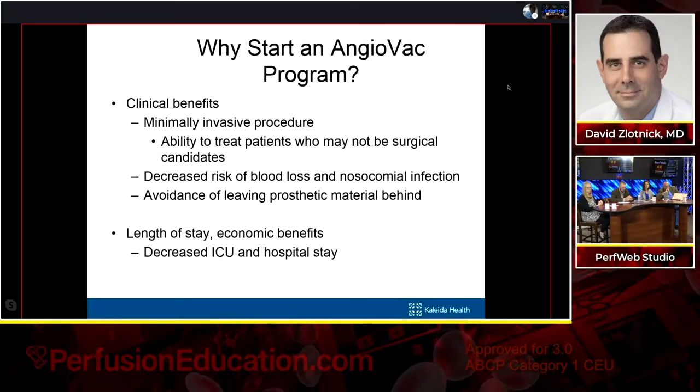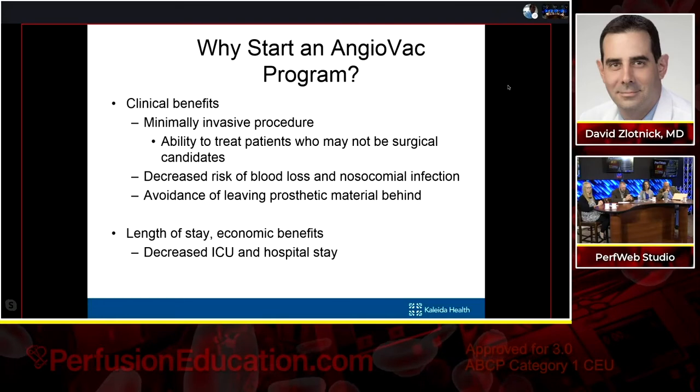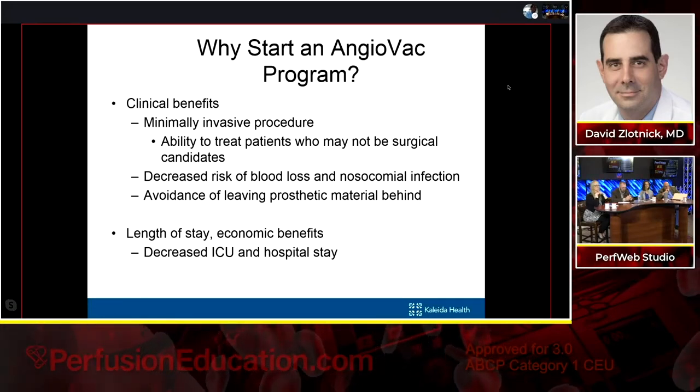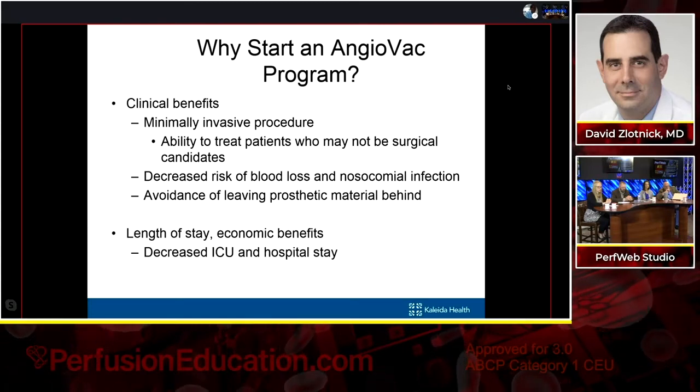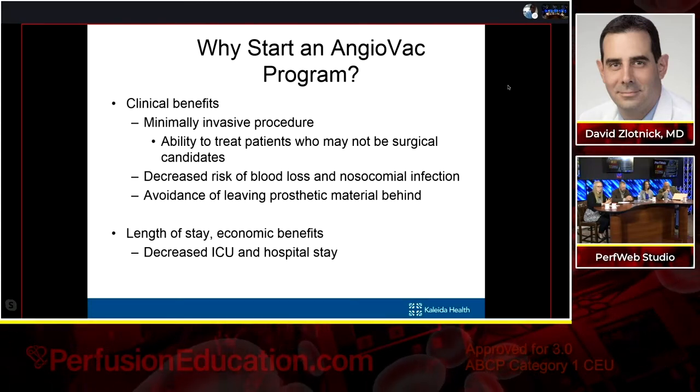So completely normal right atrial wall. So it just shows you that even though we're not getting complete debulking of every infectious material, we're debulking enough to allow the IV antibiotic therapy to really go in and finish the job.